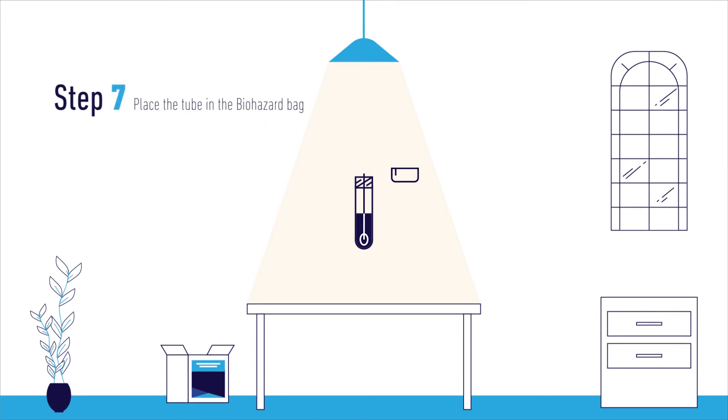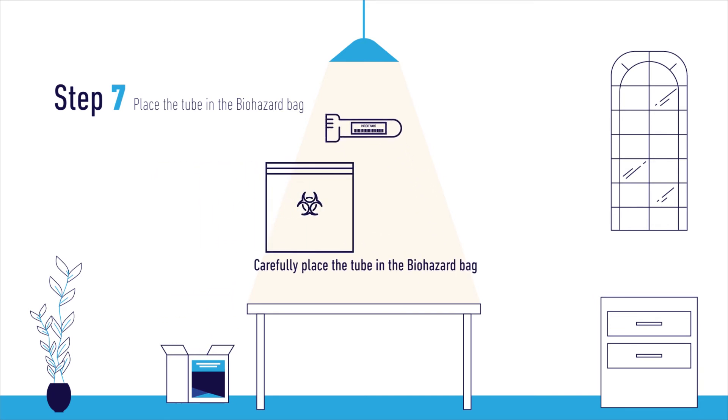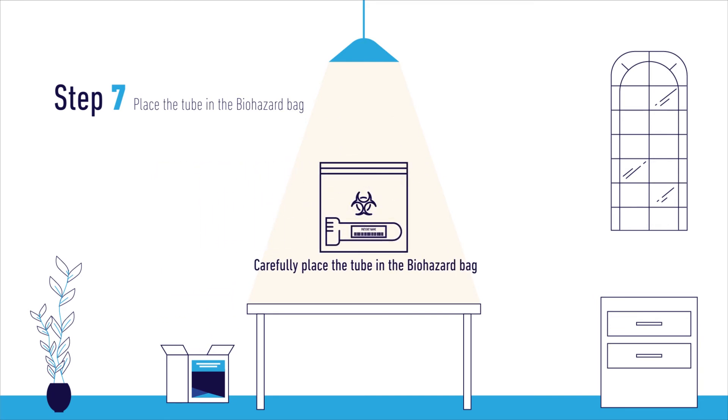Step 7. With the tip of the swab now in the tube, carefully place the cap on the tube and place it into the provided biohazard bag. Once the tube is in the bag, place the requisition form in the back pocket of the biohazard bag.